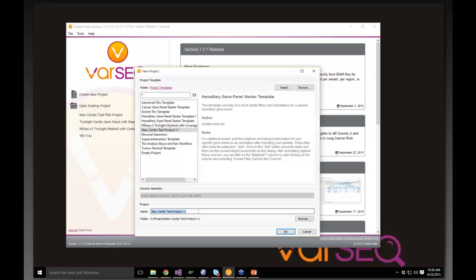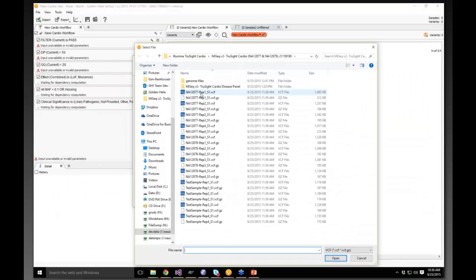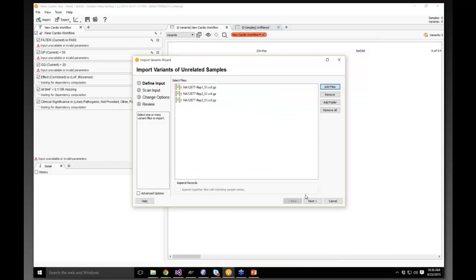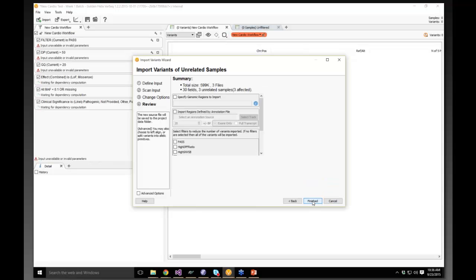And we could say, here's this week 1 batch of samples for the new cardio test, and we'll create a project that represents those set of samples and add in from the same folder. Let's grab 1, 2, and 3, and again, you could have any number of samples. You can have 100 samples per project. It's really just about what the batch-oriented nature of your work is.